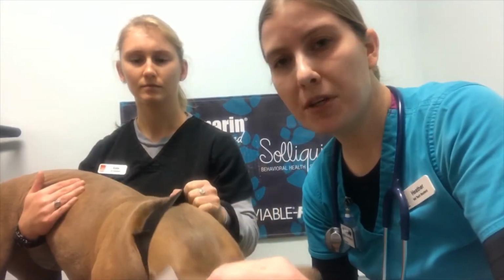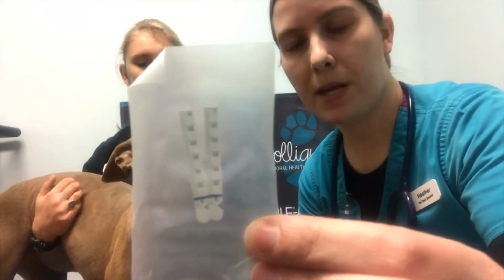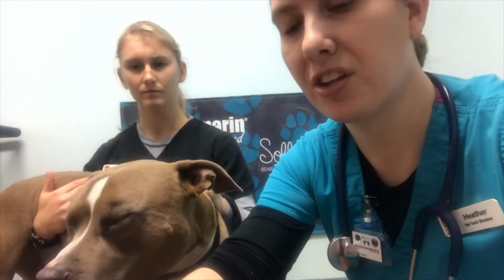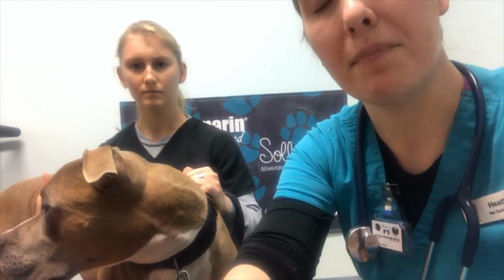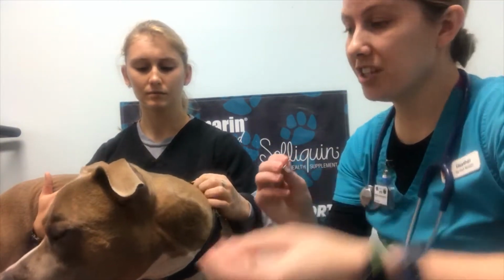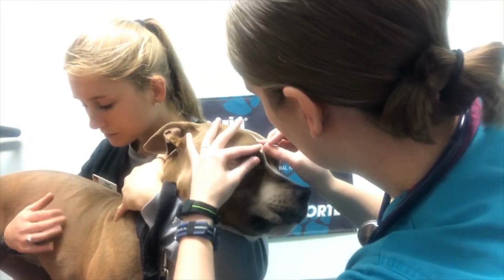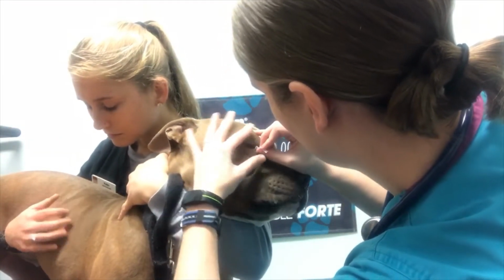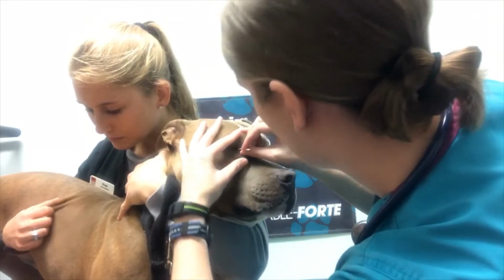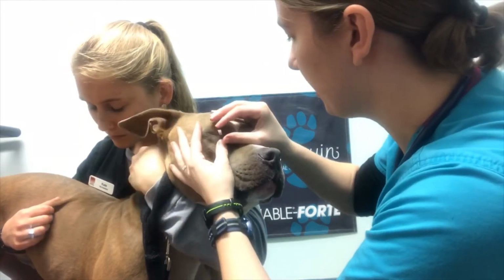So we're going to do the Schirmer tear test on Dozer here. The way this test works is we have 2 little paper strips that we place in the eye, kind of tucked under the eyelid for about a minute each. What this test does is it measures basal tear production and reflex tear production as well. There we go, bud. So I'll hold it there for 60 seconds.